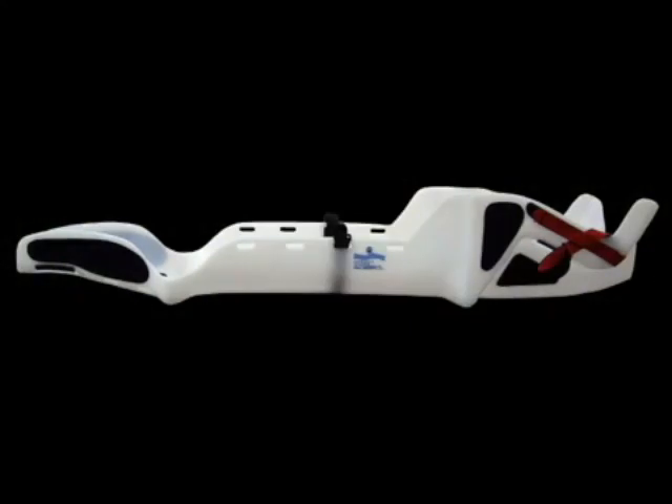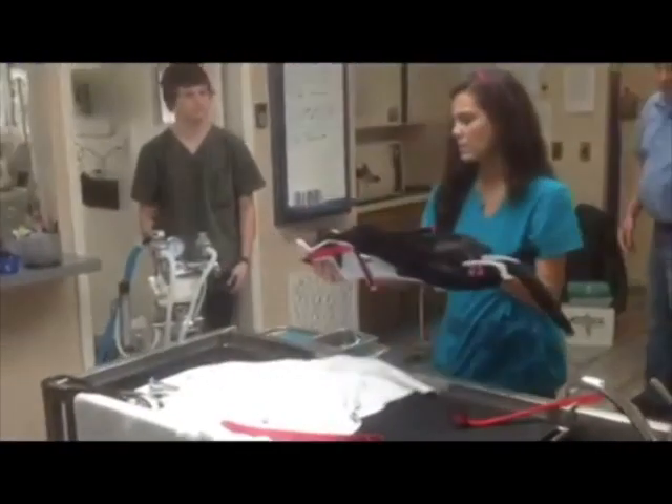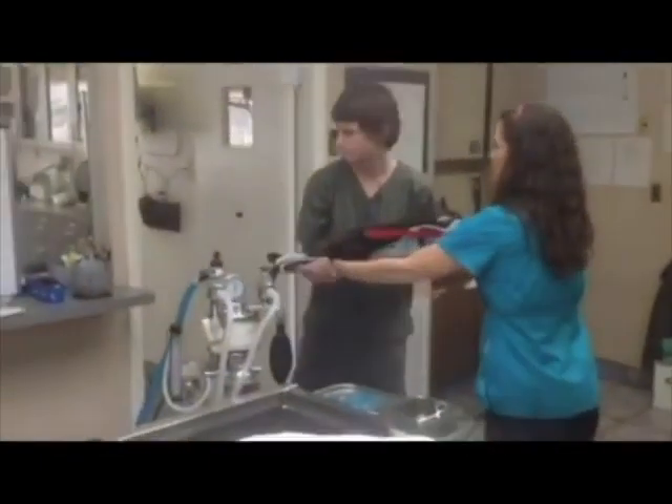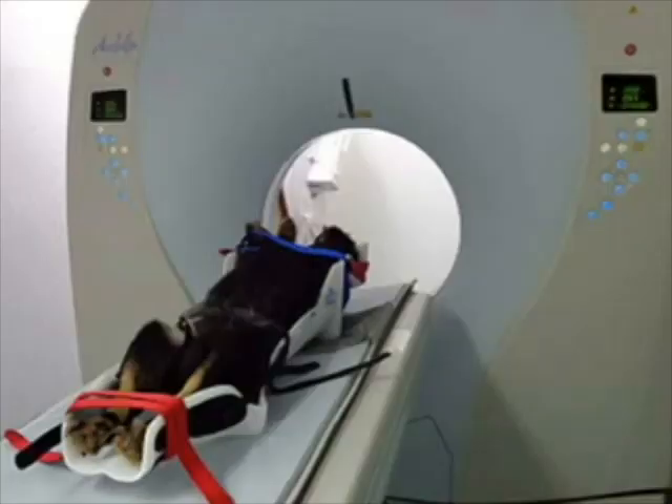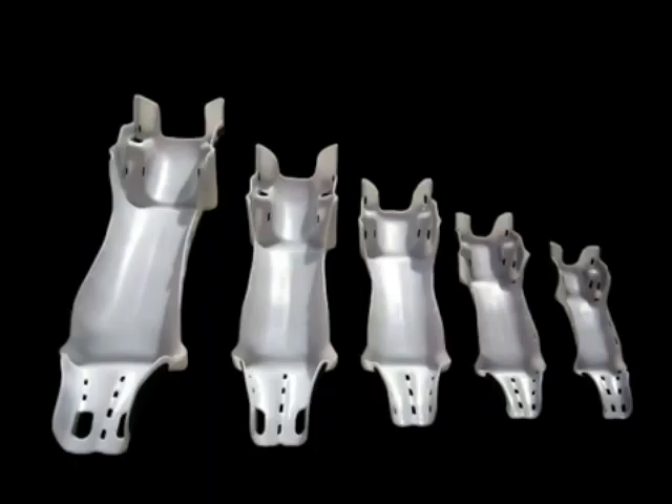The Positioner is a radiotransparent positioning cradle designed to secure patients for surgery, radiography, computerized tomography, ultrasound, and even dentistry. Available in five sizes and capable of containing patients from 5 to 120 pounds.